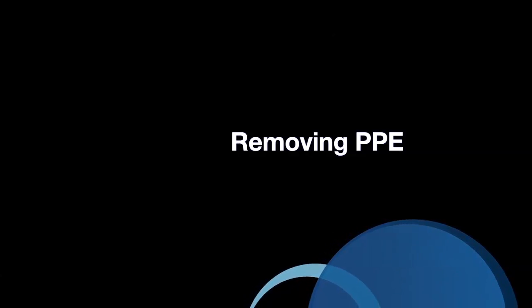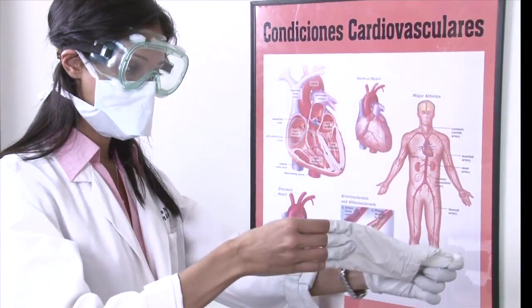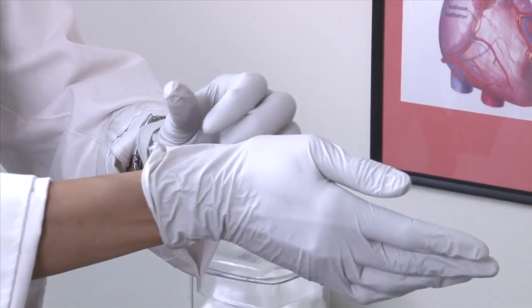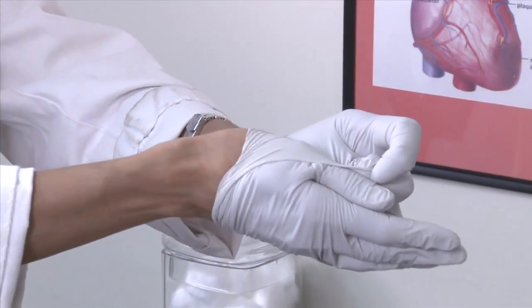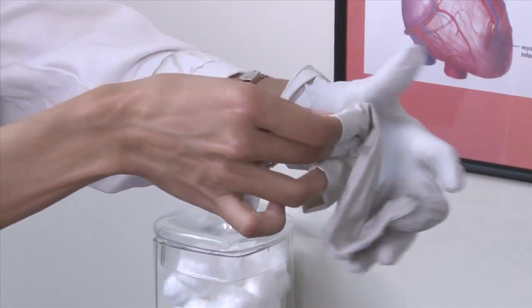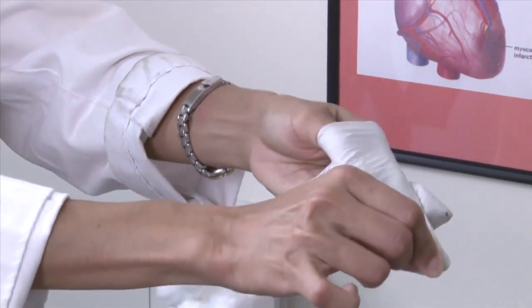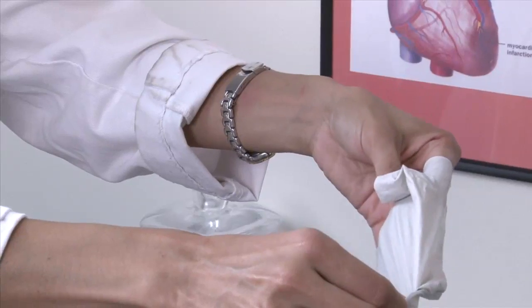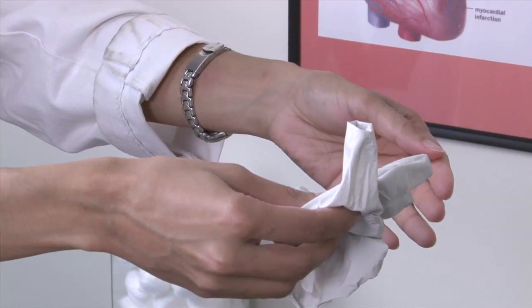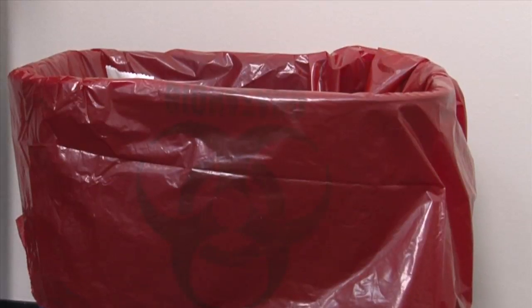Removing PPE. Step 1: Remove your gloves by grasping the outside edge near the wrist and peeling away from the hand, turning the glove inside out. Hold the glove in the opposite gloved hand. Slide the ungloved finger under the wrist of the remaining glove and peel off from the inside, creating a bag for both gloves. Discard the gloves in the biosafety bag.